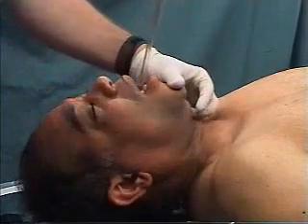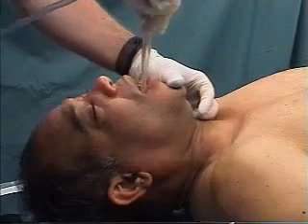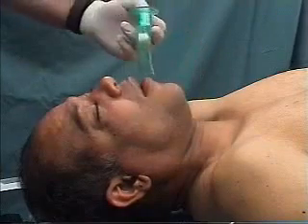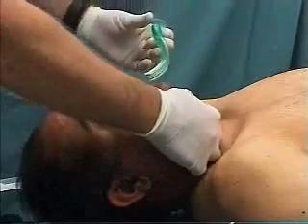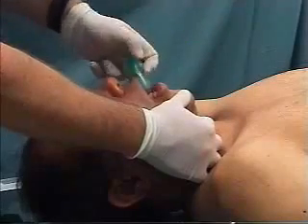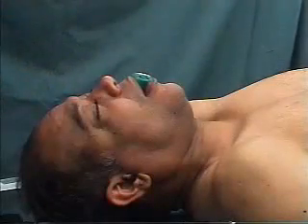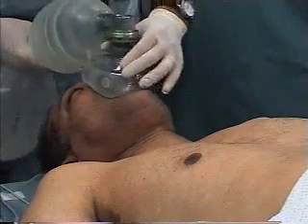If spontaneous ventilation is not returned, suction the airway to remove secretions, blood, and vomitus. Select the appropriate size oral airway. Insert it backwards as it enters the mouth and rotate it forward as it passes the tongue. Use the oral airway in the unconscious patient only, since it may induce vomiting in a patient with intact gag reflex. Now try positive pressure ventilation with bag and mask.